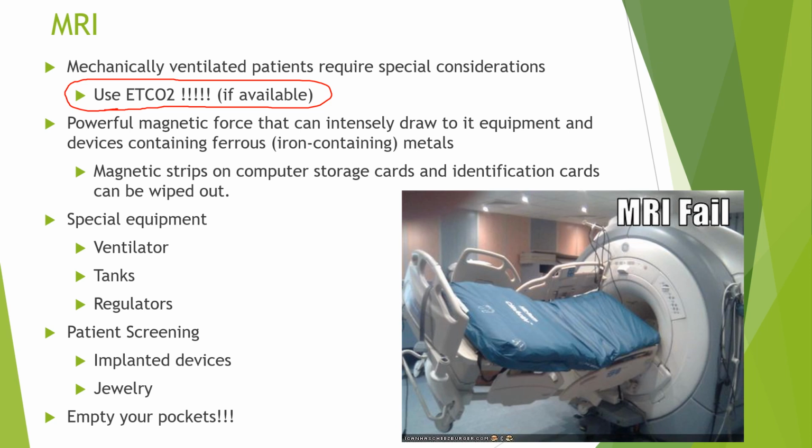The only thing on these patients that is not affected, as of recording this, by the magnets, as far as the waveforms you'll see on their monitoring equipment, is the end-tidal CO2. If I'm seeing changes in end-tidal CO2, then A, they're still connected to the ventilator, and B, there's still blood flow going to them. Remember, you're not going to get end-tidal CO2 if their heart stops. There's no blood going to the lungs, so their end-tidal CO2 will drop. It tells me about perfusion and ventilation, and that's why I'm a big stressor of it.